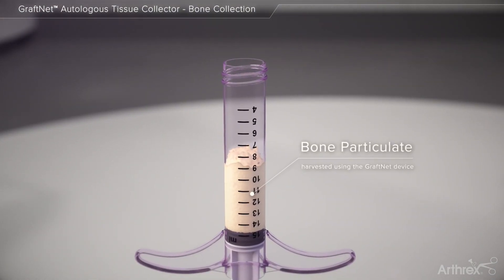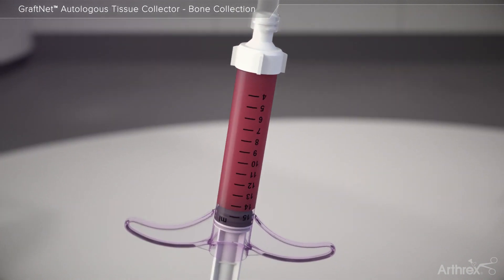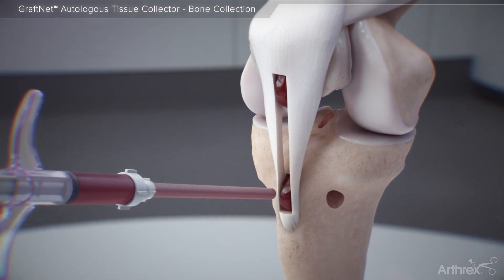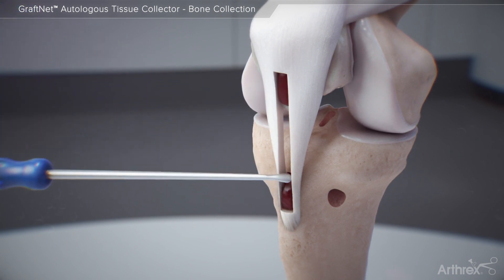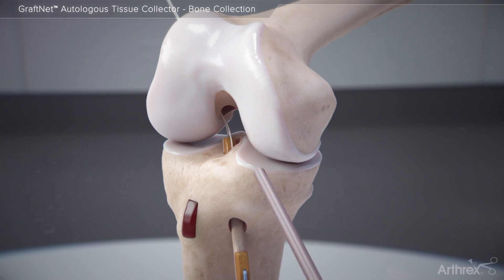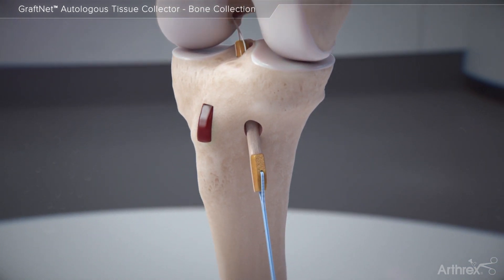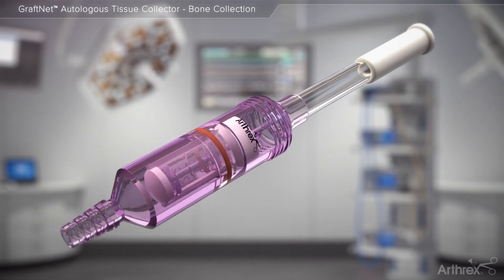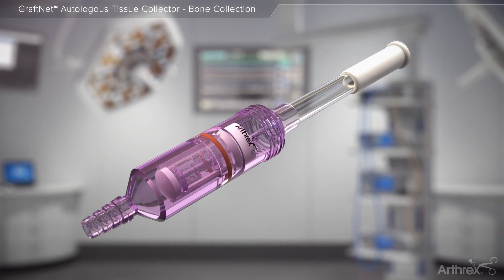Following mixing of the collected bone graft with concentrated PRP from the ANGEL CPRP system, the graft may be delivered to fill the BTB harvest site or to fill the ACL tunnels when delivering the ACL graft. GrafNet autologous tissue collector makes gaining access to autologous tissue as simple as resect and collect.